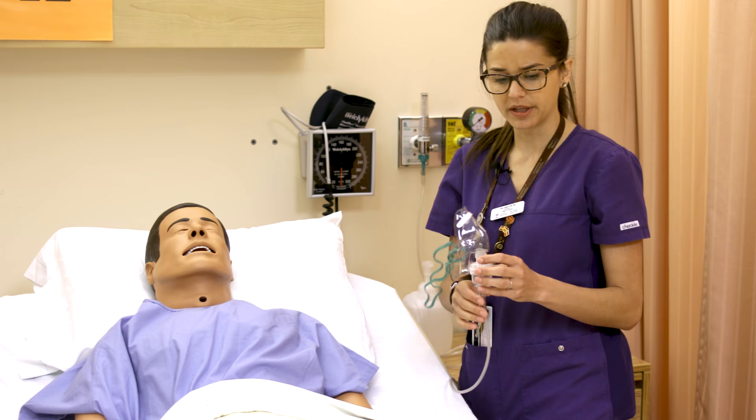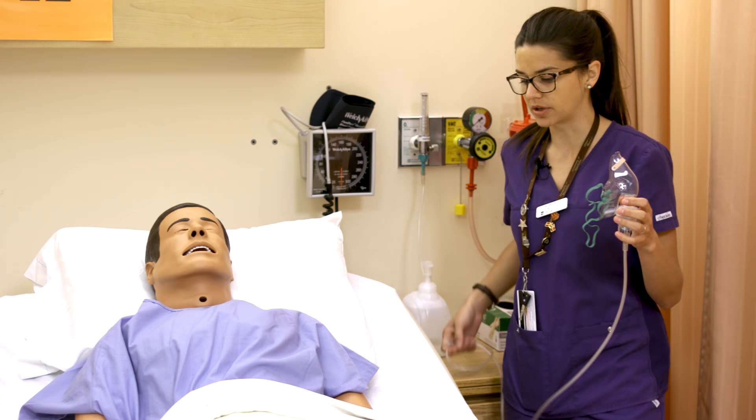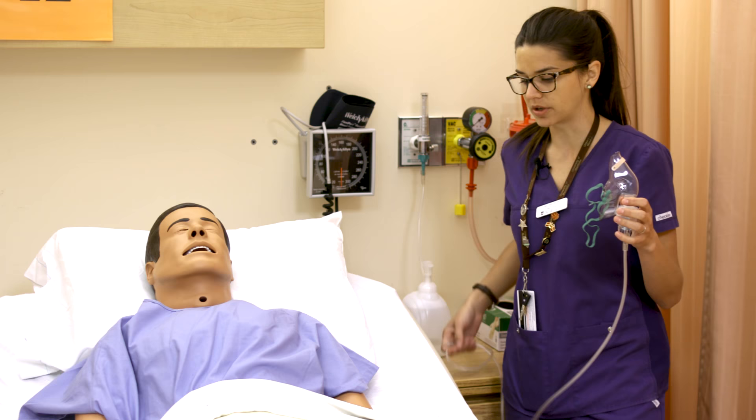In some situations, especially with Atrovent, you may want to cover the patient's eyes or ask them to close their eyes, as it can be irritating — it is an anticholinergic. Keep those points in mind when delivering medications via nebulizer, whether using the mouthpiece or face mask. That's it for nebulizers.